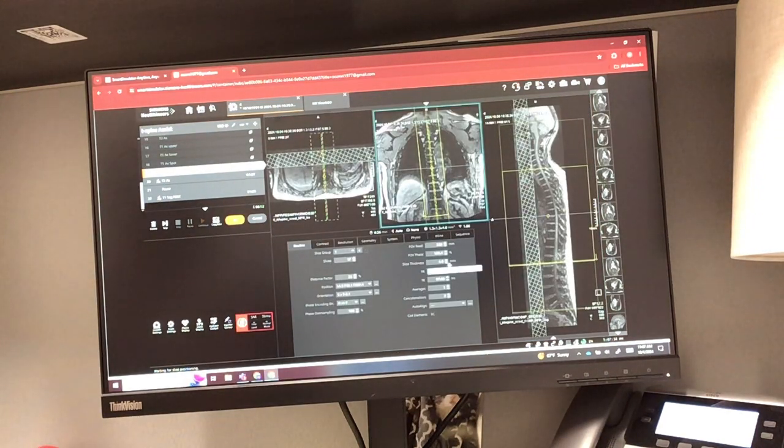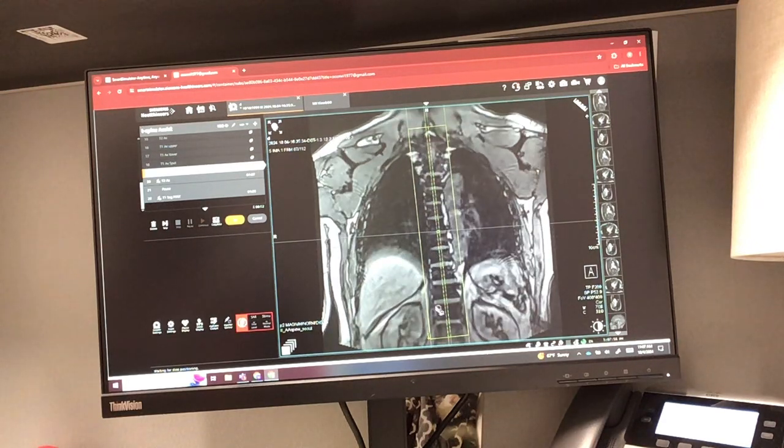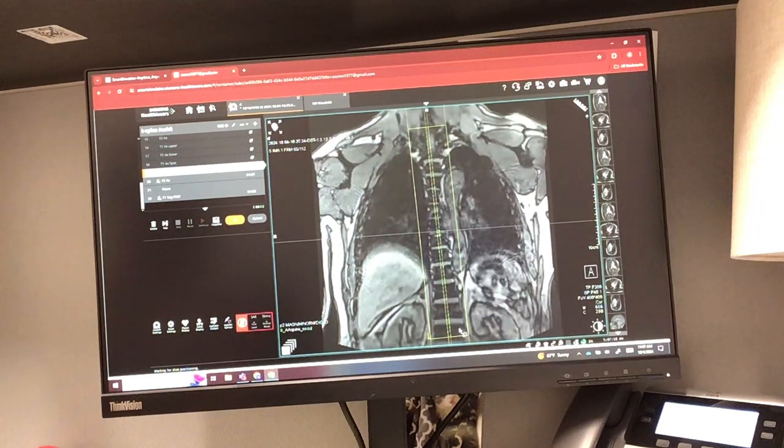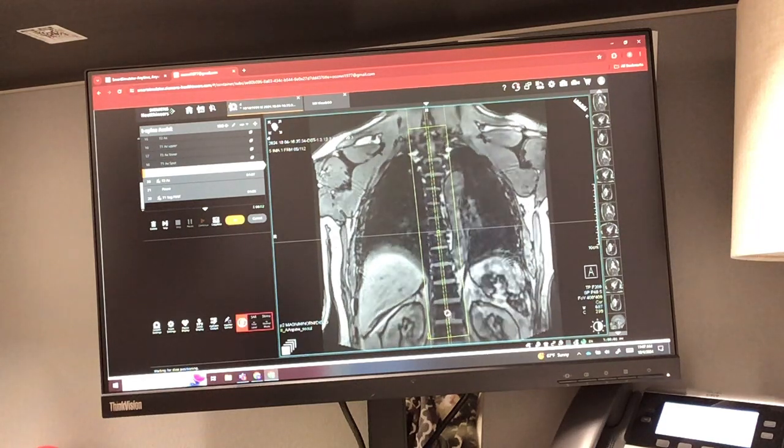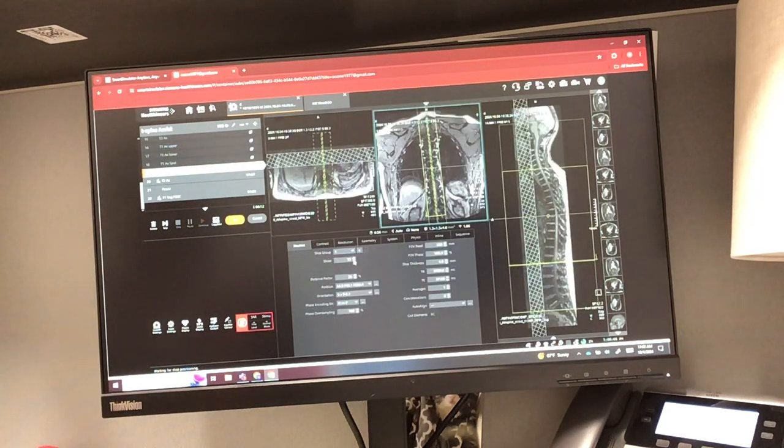With a 4 thickness and a 1 gap, I can probably take that down to 15 slices. 17's a lot. You could probably even get away with 13, depending on whether or not you want all of the transverse processes in there. But even with 13, according to your lab manual, you just have to cover all of your vertebral body from right to left. And you are with 13 at a 4-1 gap. So 13 slices are okay, 15's okay too.